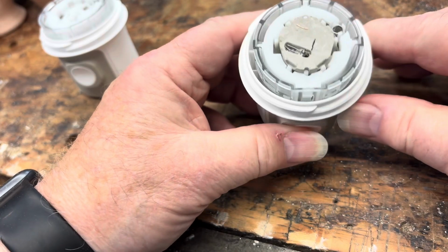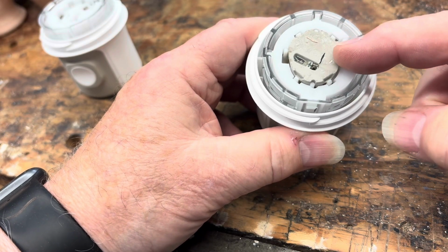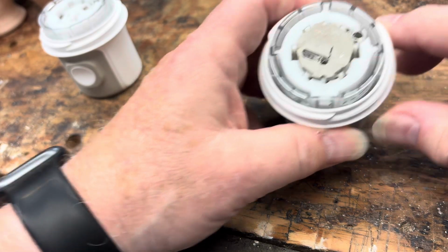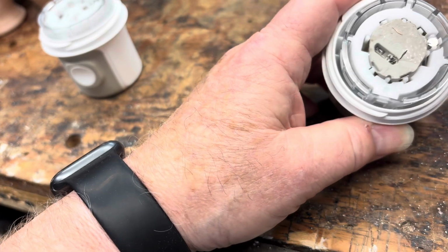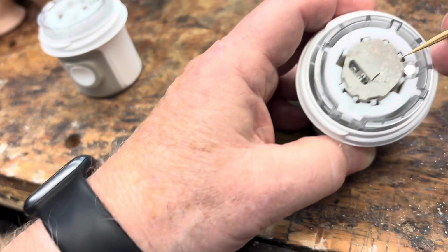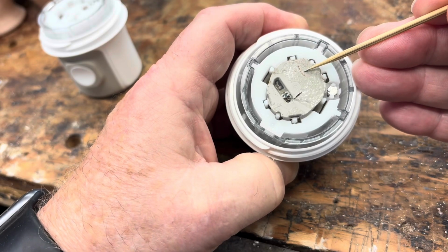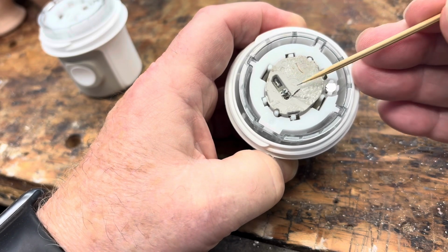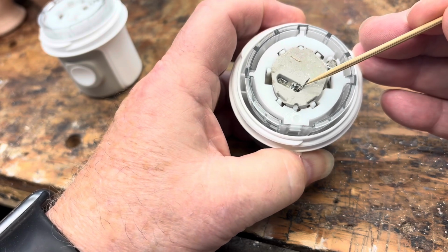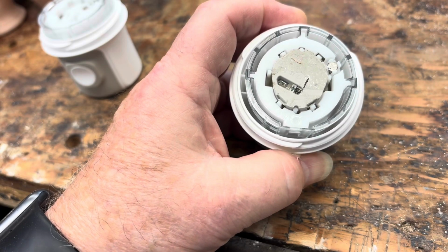This is what one looks like after it's been fired. This is the monitor itself. I've cut off the adhesive. There is a needle, a metal probe here, that I think was originally attached to the monitor. This is what I'll call a needle or sleeve that fits around that probe to get it inserted into the patient's arm.